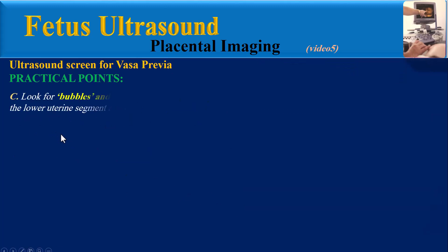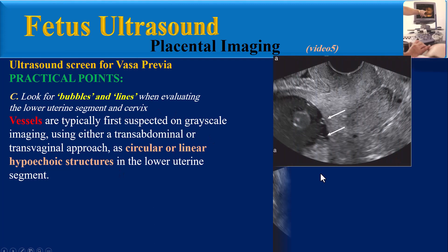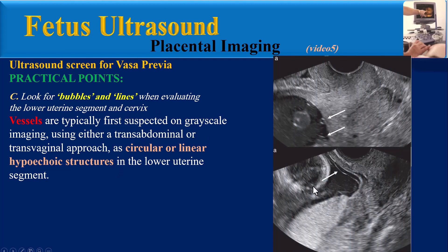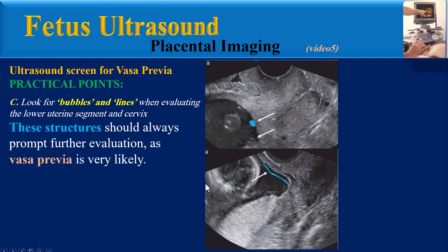Another practical point: look for bubbles and lines when evaluating the lower uterine segment and cervix. Vasa Previa are typically first suspected on grayscale imaging using either a transabdominal or transvaginal approach as circular or linear hypoechoic structures in the lower uterine segment. For teaching purposes, they may be more easily remembered as either bubbles or lines in the lower segment. These structures should always prompt further evaluation as Vasa Previa is very likely.